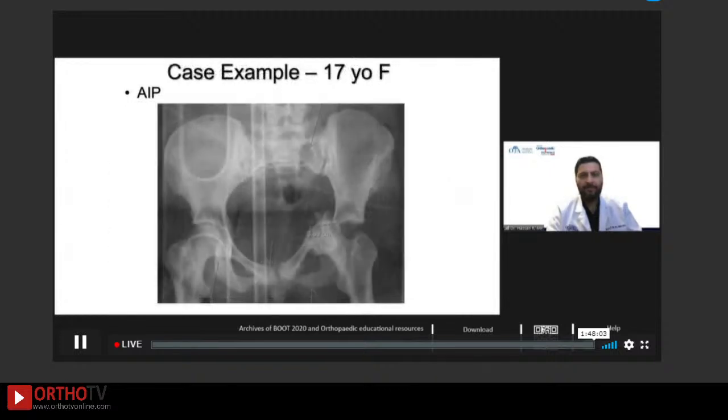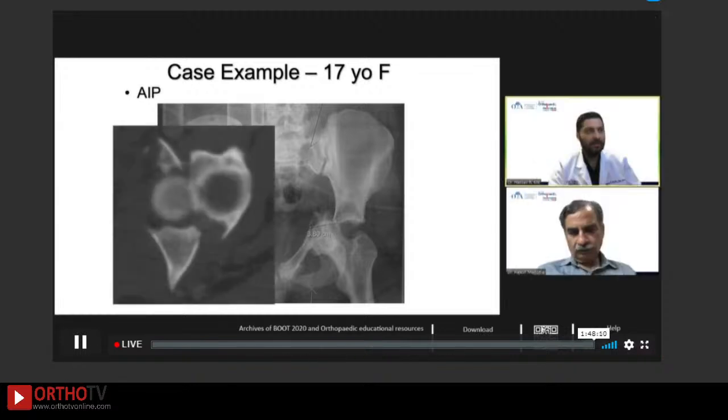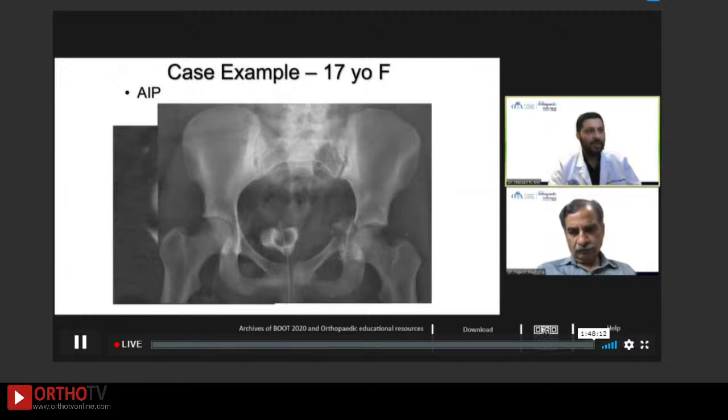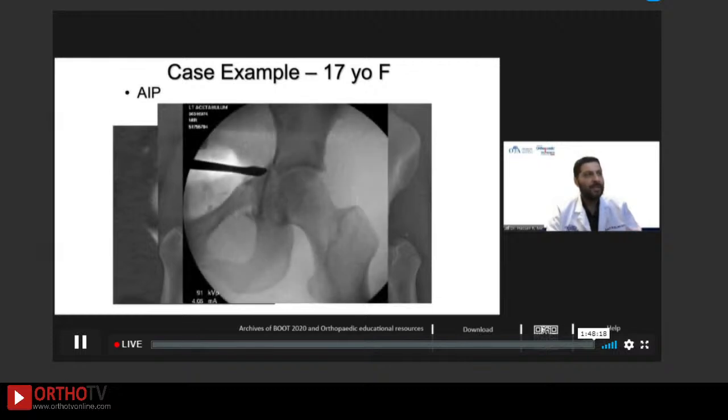Another example of a T-type fracture in a young 17-year-old female with a marked displacement medially. And here she was after being placed into skeletal traction, a large hematoma you can see shifting her bladder across the midline. And then this is work all done through an anterior intrapelvic approach.